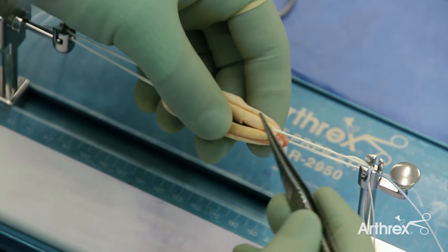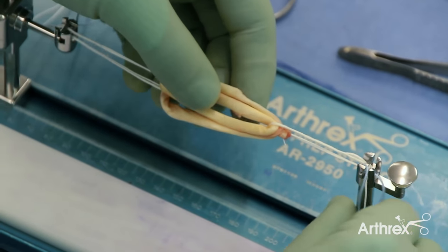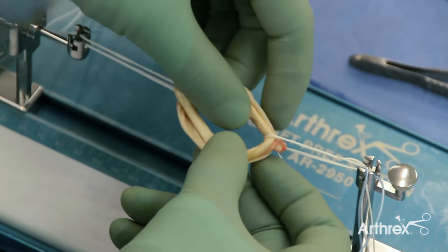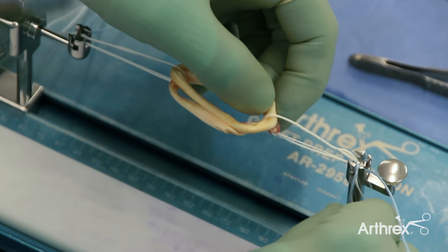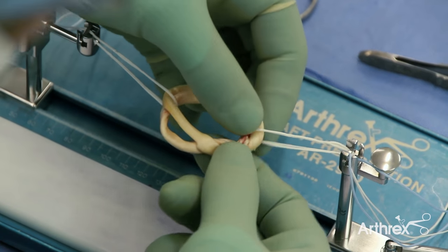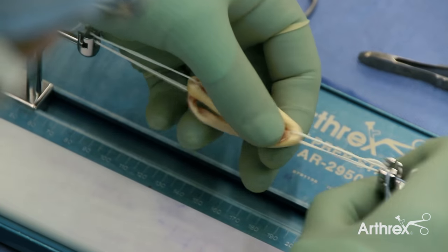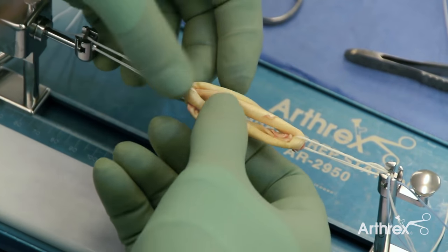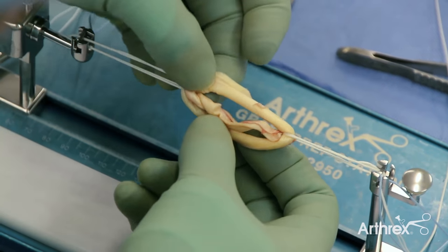The knot at this stage is on the outer loop of the graft link. This can then be manipulated onto the inner loop by simply inverting both ends of the graft. The graft is essentially turned inside out, and you can see the knot is sitting on the inner loop.